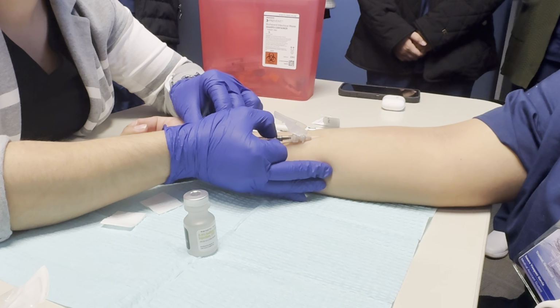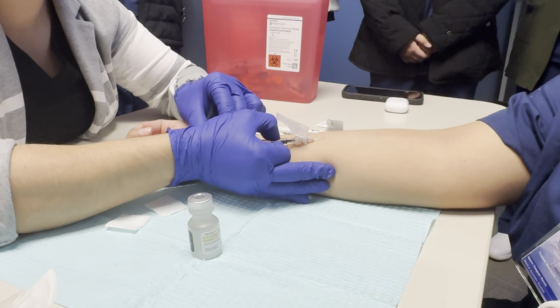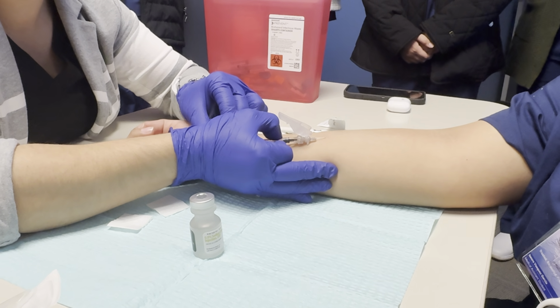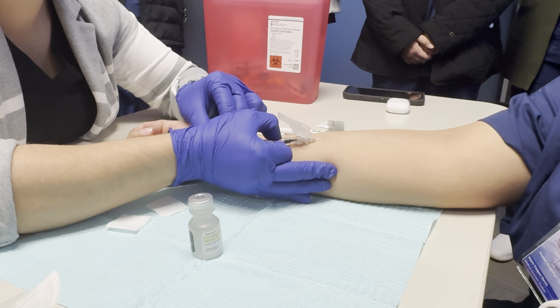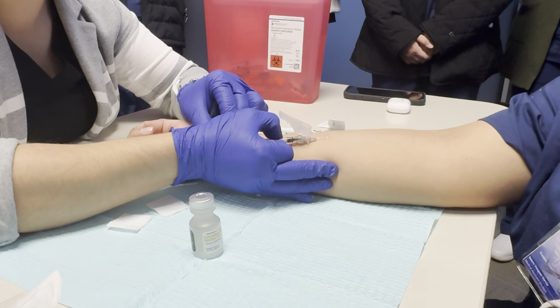The goal is to inject your medication slowly. If you inject it too fast, that's going to go under the skin, and that's not going to give you the wheel. If you don't get that wheel, that's not a good thing. You want to make sure when you inject the medication, you get a wheel. I can't tell you how slow or how fast you go until you get a habit of it. So when you inject your patient, you will understand, is this too fast or is this too slow?